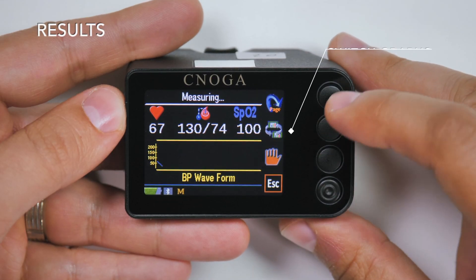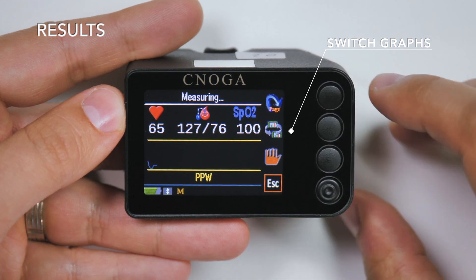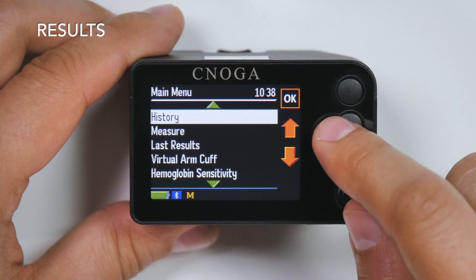You can switch between graphical display modes by pressing the switch graphs icons. To review your previous results, press history or last results on the main menu.